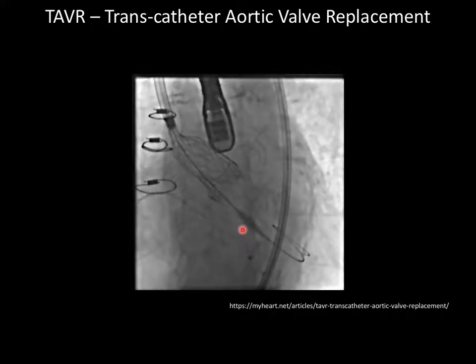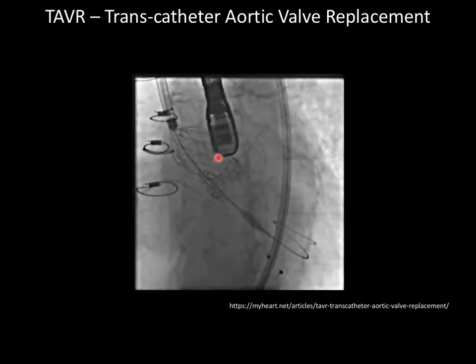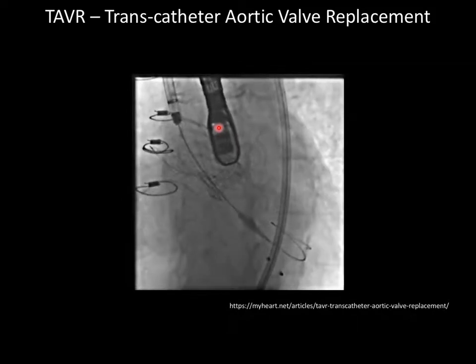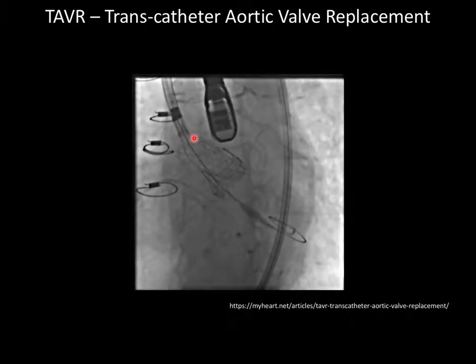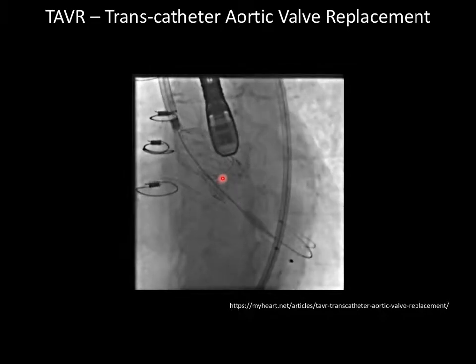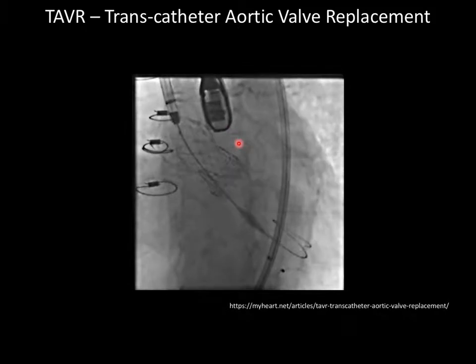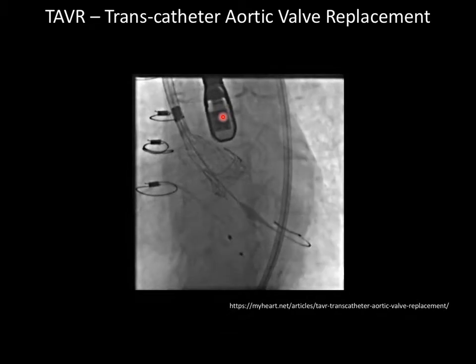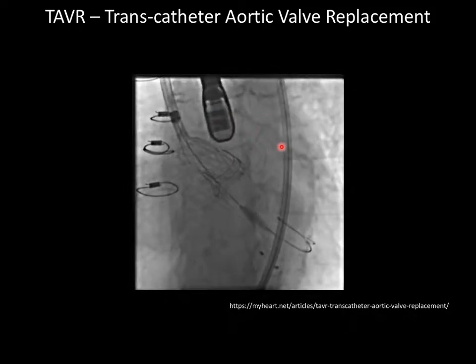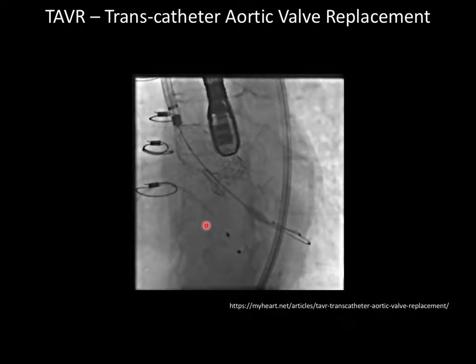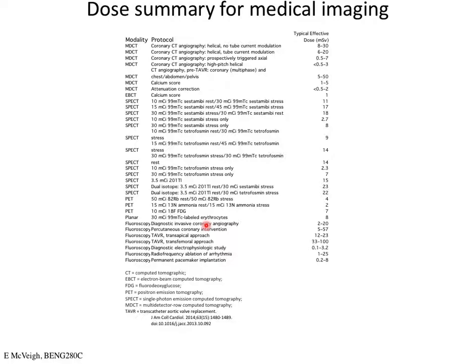During the TAVR procedure, fluoroscopy shows the valve being placed, while a transesophageal echocardiography probe down the patient's esophagus makes echo images of the valve being inflated. You can see the sheath being pulled back, revealing the cage structure with valve leaflets. The delivery catheter is pretty big but is being made smaller.